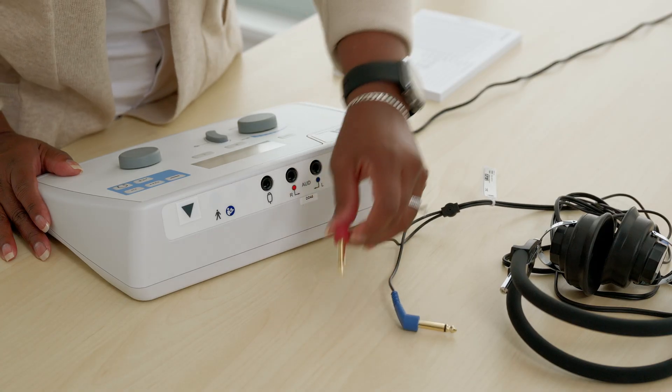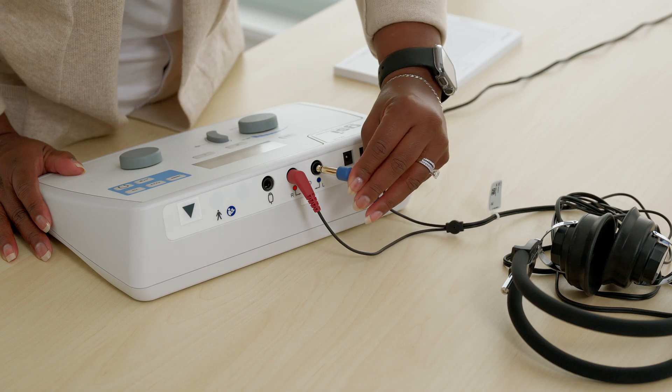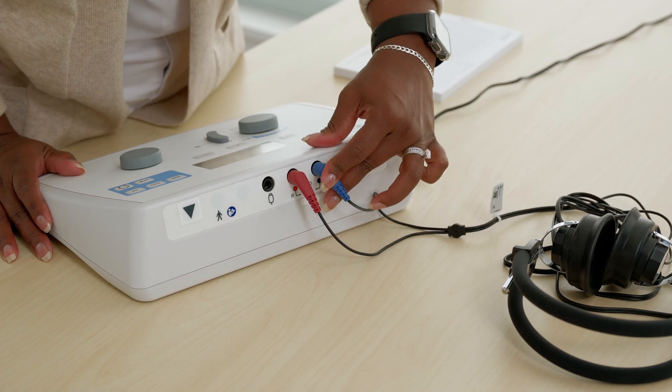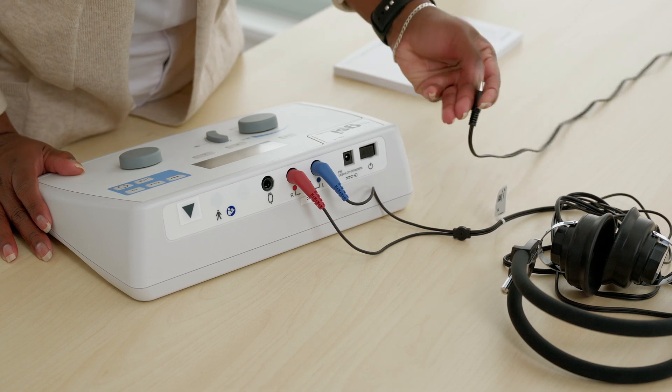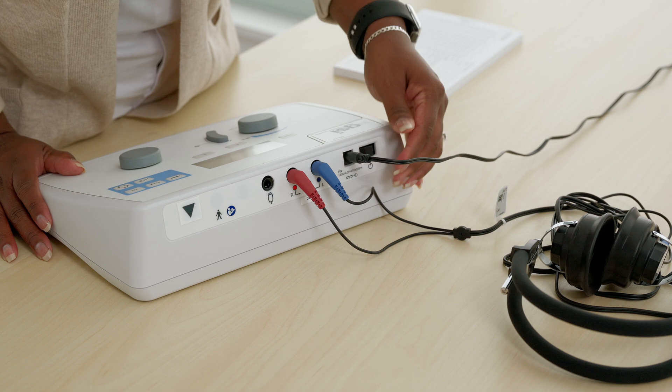To set up the GSI 18 for testing, first plug the transducers into the back of the instrument. Make sure to plug the red right earphone connector into the jack labeled R for right, and the blue left earphone connector into the jack labeled L for left. Then plug in the power cable or ensure that batteries are inserted into the battery compartment on the bottom of the device. Next, power on the instrument. Finally, make your signal selections and you are ready to test.